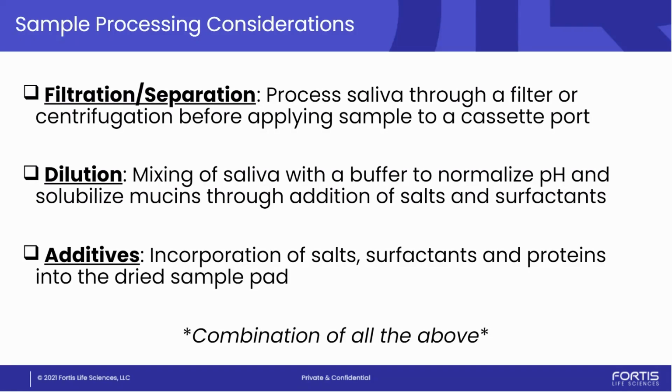We all know that antibodies work and function at preferred pH ranges. So getting each sample to be at the certain pH is going to be critical. So you almost always have to have some level of salt somewhere in your assay to bring it to, say, pH 8. Surfactants are going to be critical to flow, so they help block non-specific binding through your sample pad, conjugate pad, onto the membrane. So really important to sample flow and specificity.